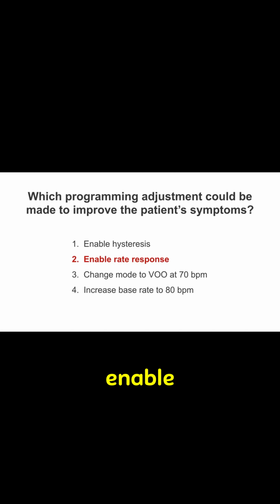If you answered enable rate response, you'd be correct. By enabling rate response, we are allowing the pacemaker to recognize when a patient is exerting themselves and artificially increase the heart rate. So the pacemaker itself will increase the patient's heart rate.